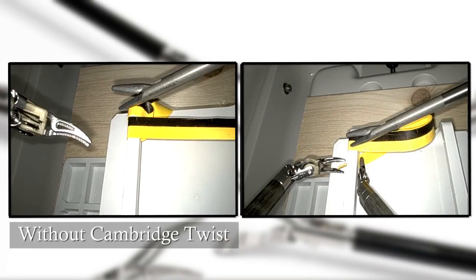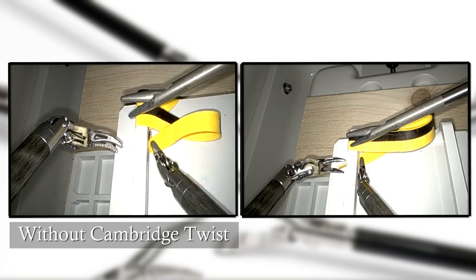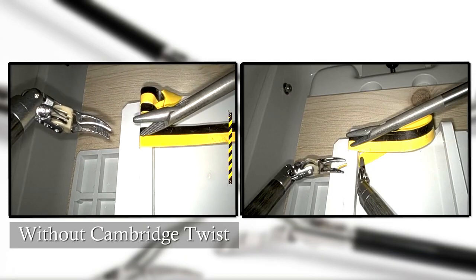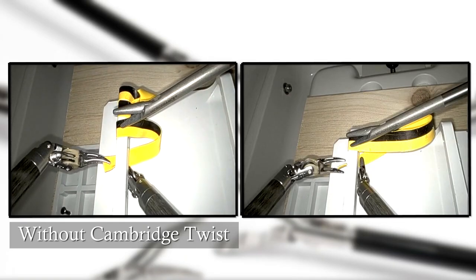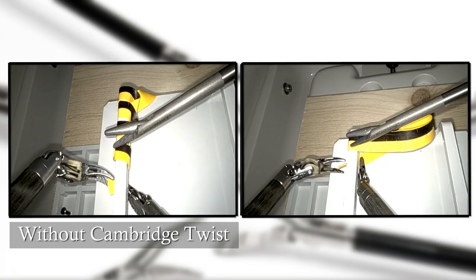The same effect can be observed with a continuous suture using the DaVinci XI robotic arms. Again, on the left side of the screen, one can observe the twisting and curling of the ribbon when the robotic needle holder is not turned after every pass.